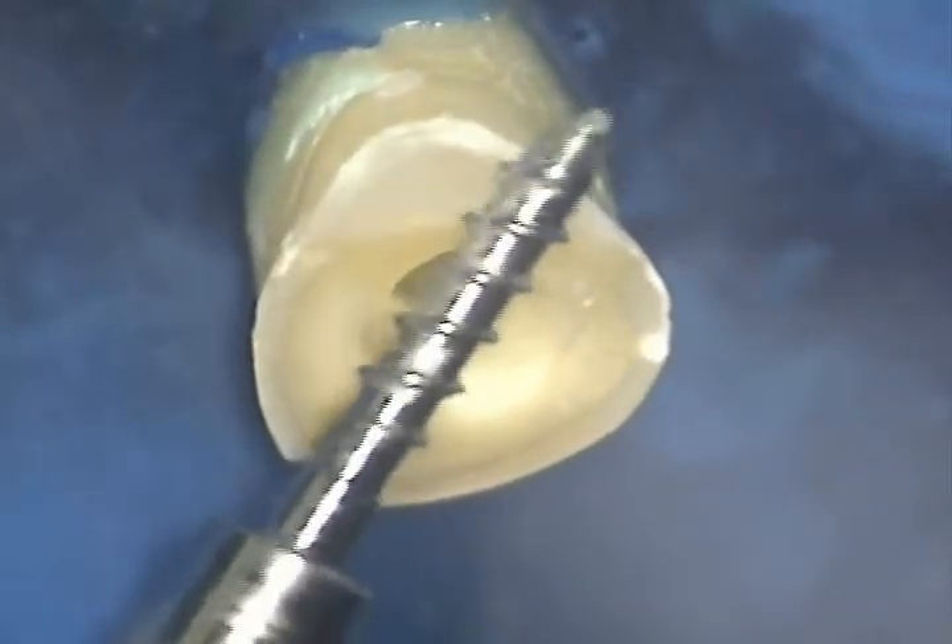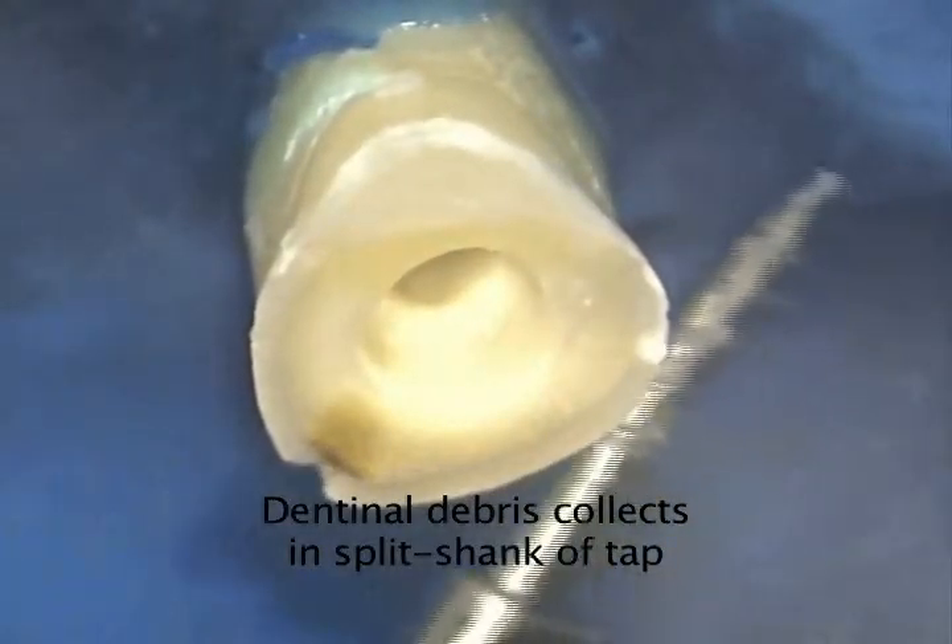If the post hole is too short, thread the tap in as far as it will go. Once the threads are created, the tap is removed from the root.